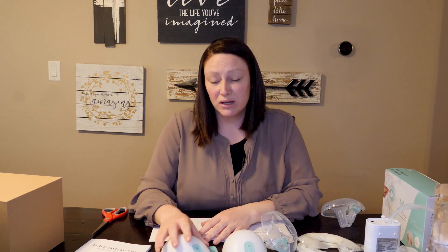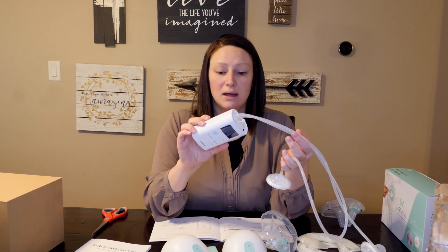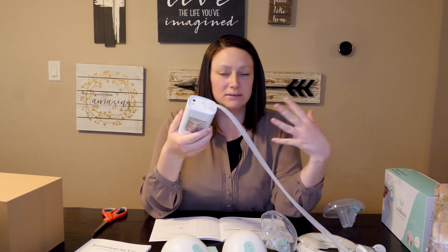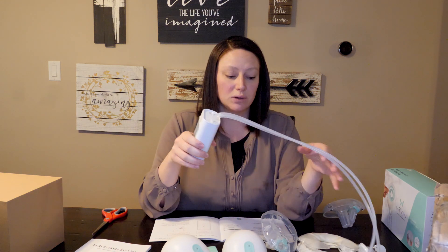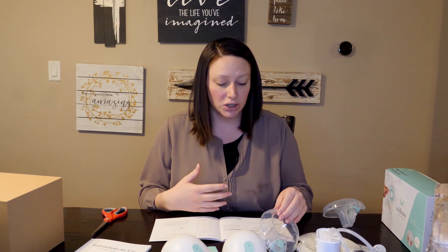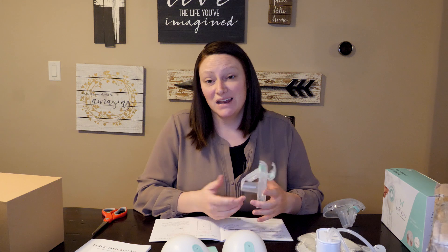The suction was pretty comfortable from what I could tell. I wanted to show you the pump I've been using — this is the Spectra. It has the regular milk containers and flanges, and you have to wear a bra attachment to move around or use your arms. With the Willow, it was much easier because it just sat in your bra, and I was able to move around and do whatever I wanted. I rearranged one of my cabinets and I didn't have any leakage.